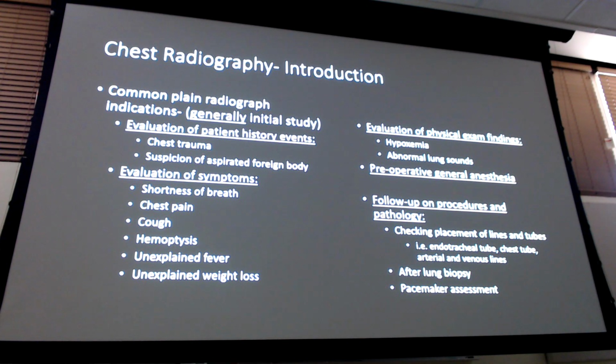Plain radiograph, usually in most cases, much like with MSK, is the initial study. Generally. There are a few nuances which we will talk about when we get to them where it's not. But if you see anything where they're asking you the initial study, chest x-ray is probably right the majority of the time. Why? Again, because it's quick, right? And there's so much going on in the chest that even if there's something that I'm concerned about, that I want to get a CT or some other kind of study, I don't want to miss something else that's going on. And the x-ray can actually tell us a lot.